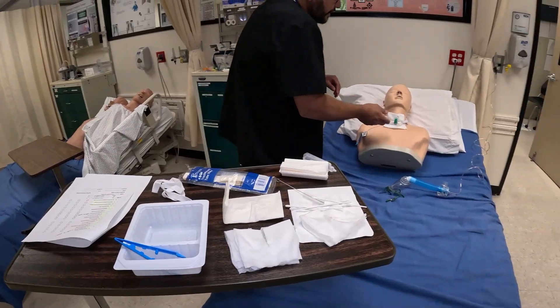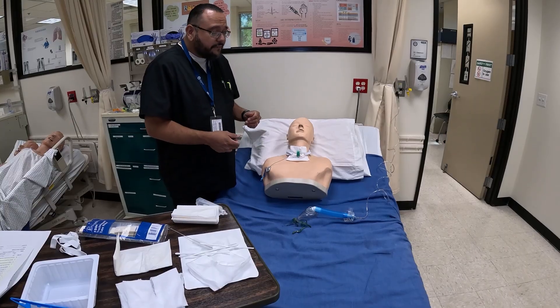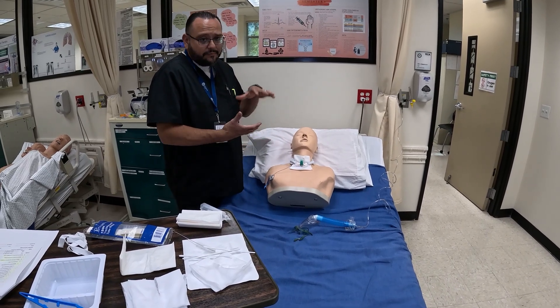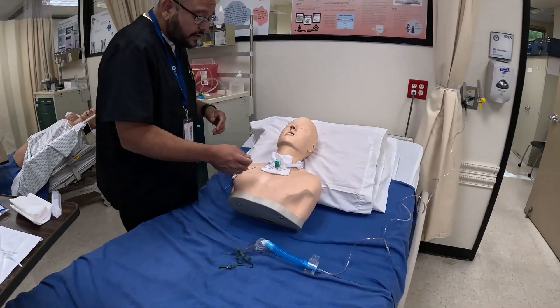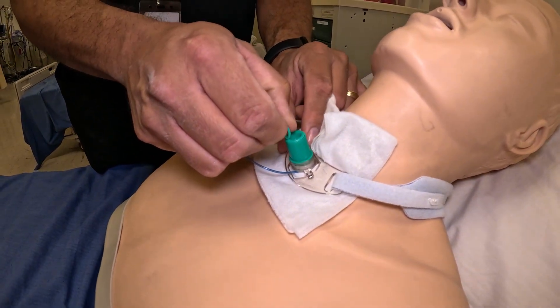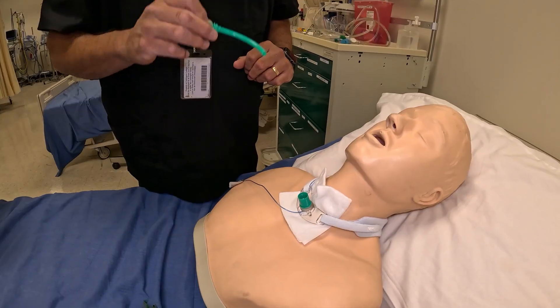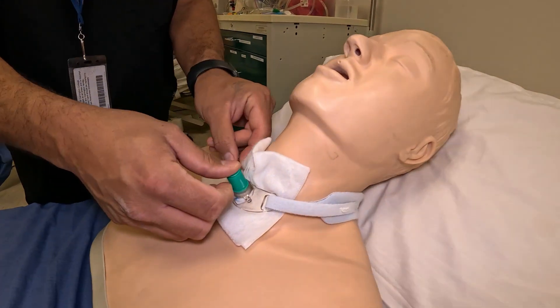On our lab competency it recommends taking out the inner cannula, cleaning it, and reinserting it, but I recommend disposing of it and putting in a new one. Facilities typically carry boxes of replacements. This is a PORTEX 7 trach. To remove the inner cannula, there's a little ring here — provide support to your patient, pull it out, dispose of it, grab a new one, and put it back in. Be aware that inserting it may stimulate a cough reflex.